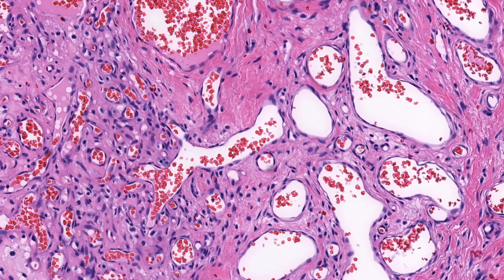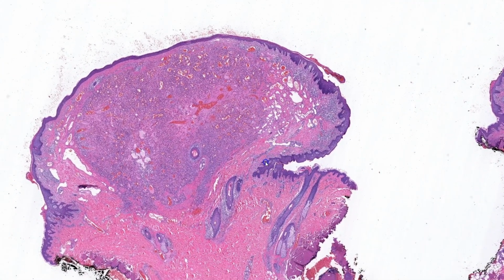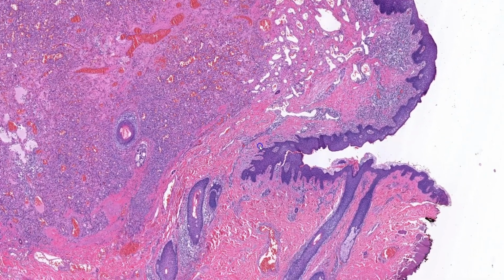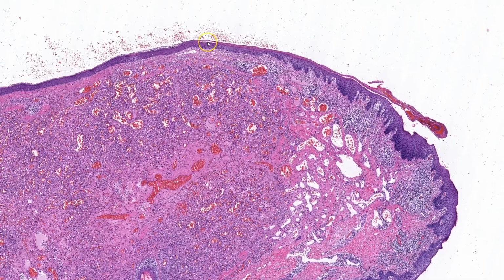Other histologic features to look for include exophytic or pedunculated growth, with an epidermal collarette. This is the narrowing of the epidermis around the lesion you see here, like a collar around the neck of the tumor. Due to its growth pattern, the overlying epidermis is often eroded or ulcerated.